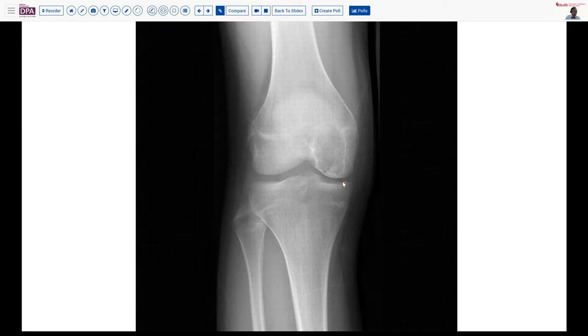Lesions that are located in the epiphysis and that begin in the epiphysis are really quite limited in terms of differential diagnosis. And so most often the radiologist can look at this lesion and say, oh, this is a chondroblastoma. And they would make that diagnosis on the basis of the location and the morphologic appearance. So the radiograph is really your gross image to help you with this diagnosis. We also see that the margins here are relatively sharply defined. There's a little bit of accentuation of calcification at the edges of this, which is also characteristic of a slow-growing, not aggressive lesion.